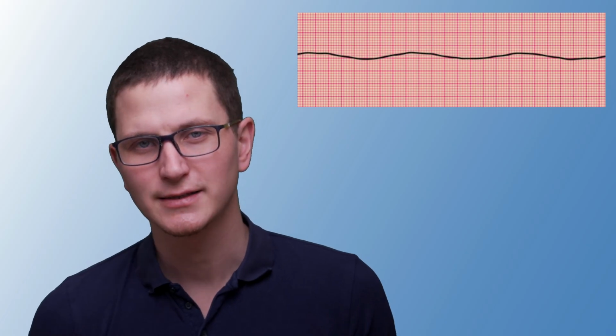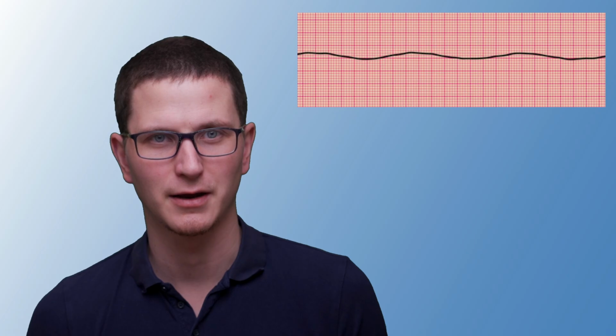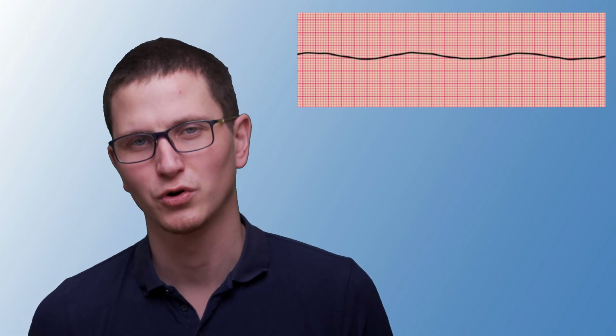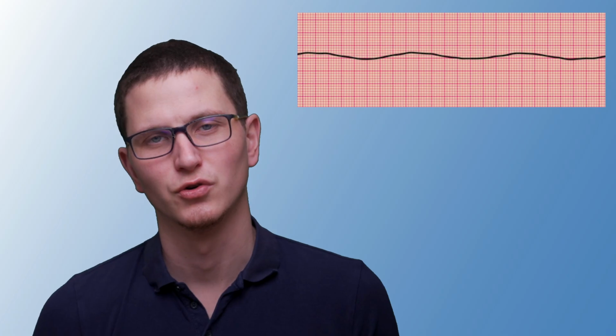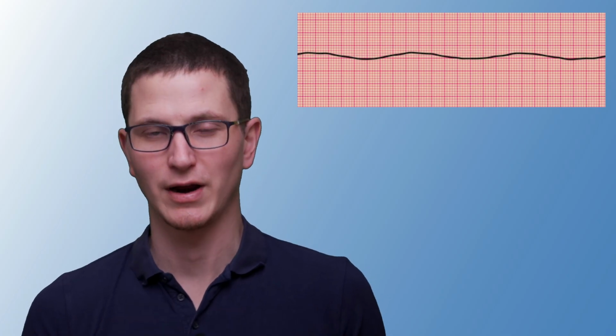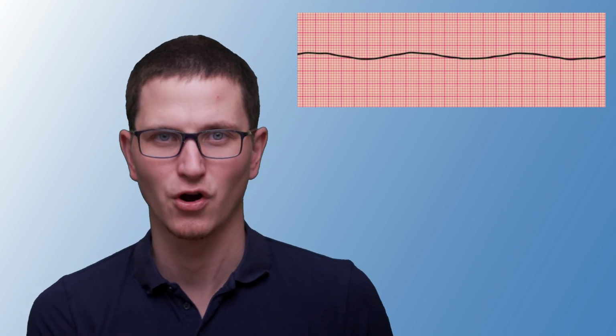Would we want to shock asystole? No, because if we shock asystole, we're just going to make it more of a flat line, which means we're just causing damage to the heart, right? We don't want to shock unnecessarily. So shocking asystole would be pointless because it's already flat, and the point of defibrillation is to cause flat lines. So hopefully the SA node takes over, but that's just not going to make any difference at this point, right? So asystole, we're not shocking because it wouldn't generate any benefit.